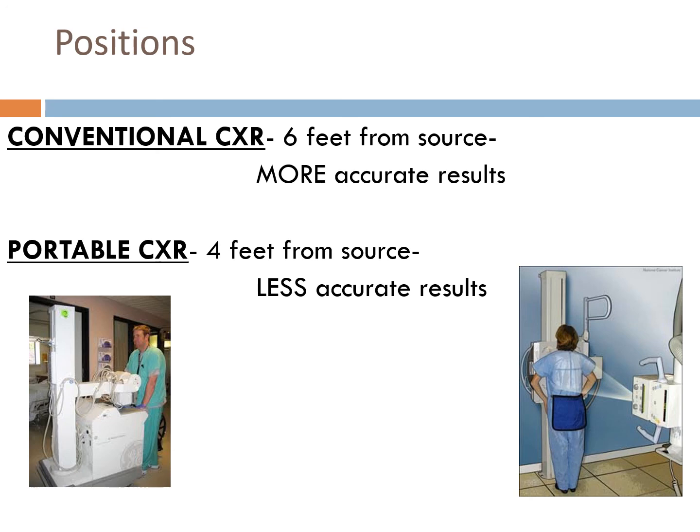Unfortunately, a portable X-ray is what we have to utilize in the ICU setting if a patient is too unstable to go down for an X-ray. Think of a lamp as an example: if you put your hand between the lamp and a surface to create a shadow, the shadow becomes smaller and sharper as the hand moves farther away from the light source and closer to the surface. So that's the less accurate, more accurate kind of thing.